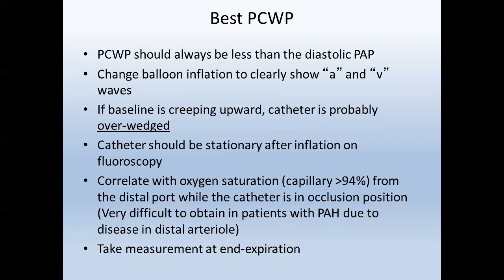So don't do that. And when you're taking a wedge pressure and your balloon is inflated and wedged, it should not be just popping. It should be stable, stationary. If it's just popping, that means you're not completely wedged yet.